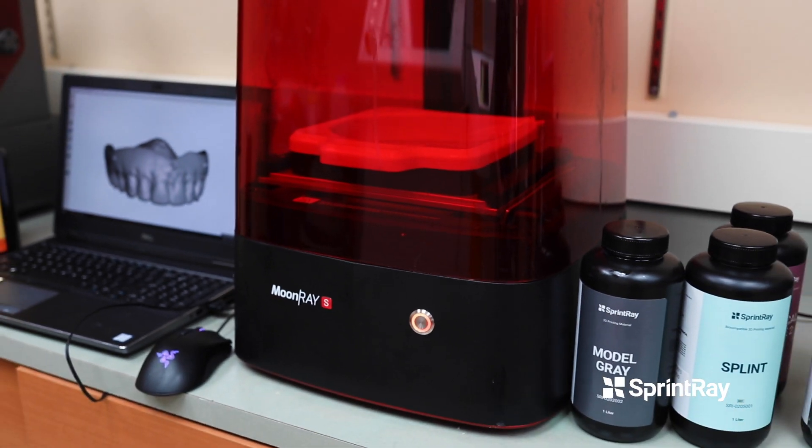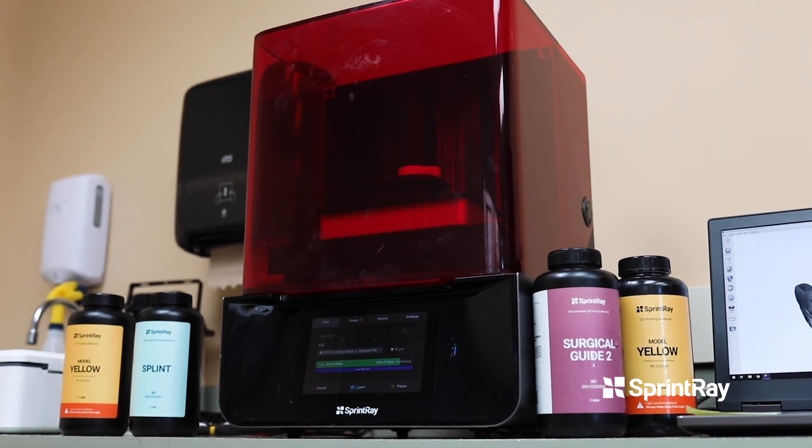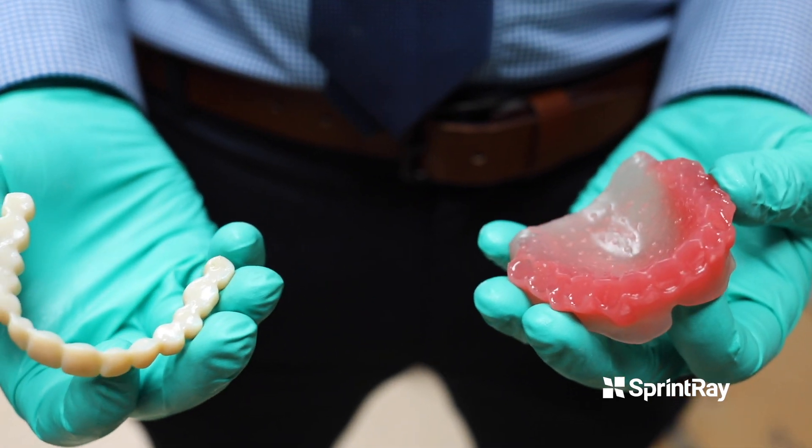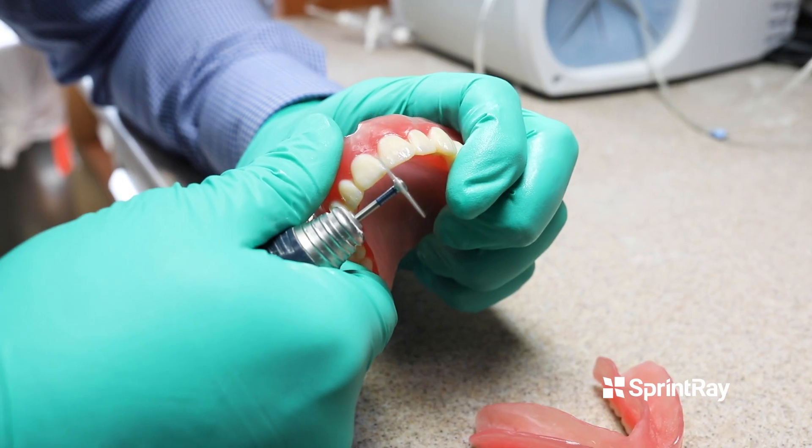At the university we have over 25 different 3D printers, and I would say our workhorse printers that we use almost exclusively are the Moonray S and the SprintRay Pro. We're printing all our dentures on the SprintRay Pro and we have a 100% success rate with our dentures right now. It's kind of unheard of because they've just catered the technology to be almost foolproof, and we're really taking advantage of the systems that we have here.